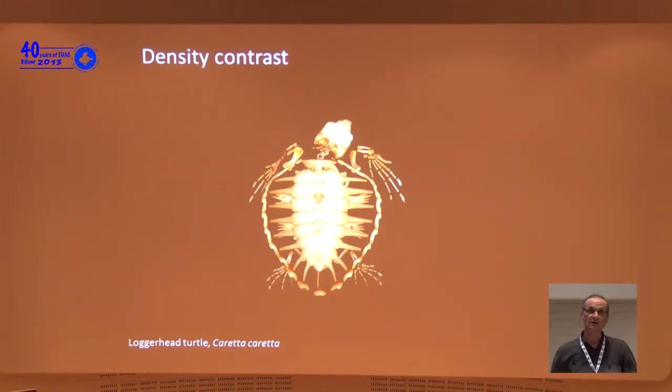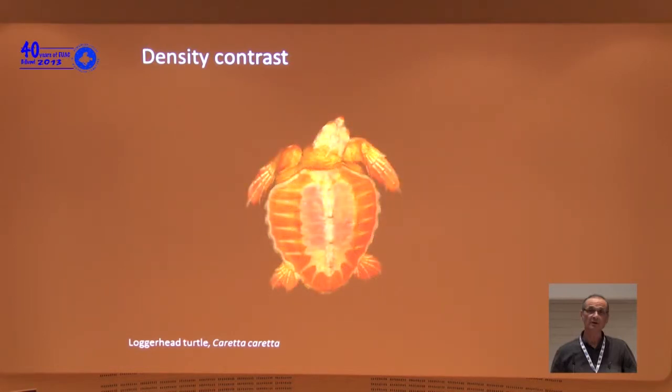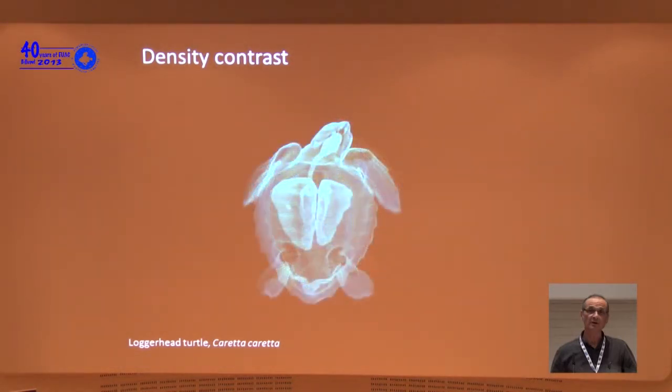We can look at Caretta caretta. All the animals were alive. And we can see the air part and the lungs. I had marked the lungs.